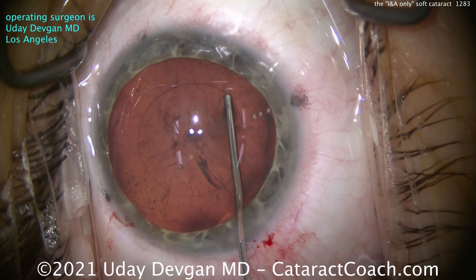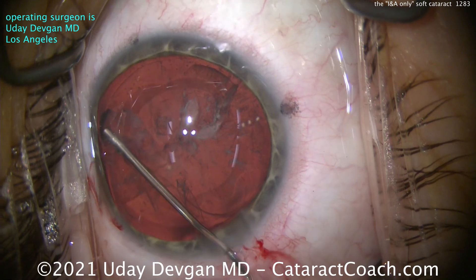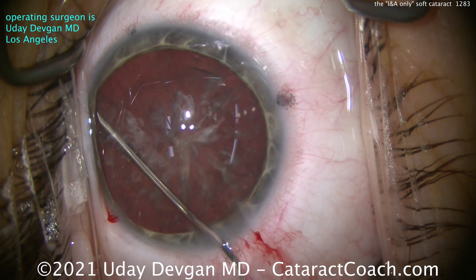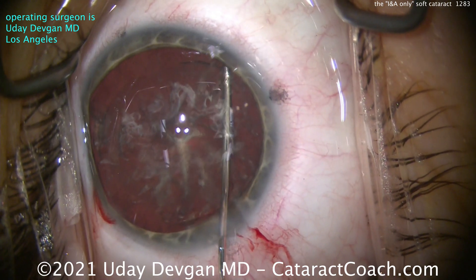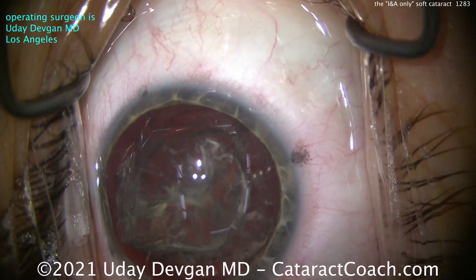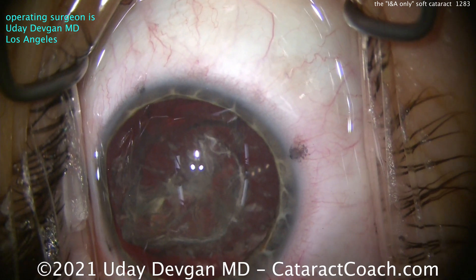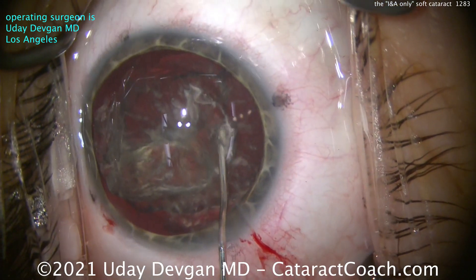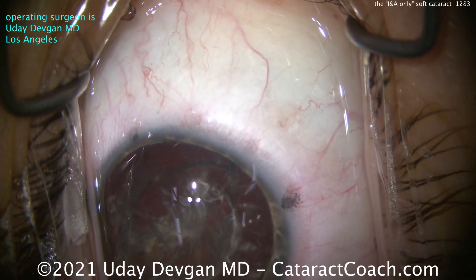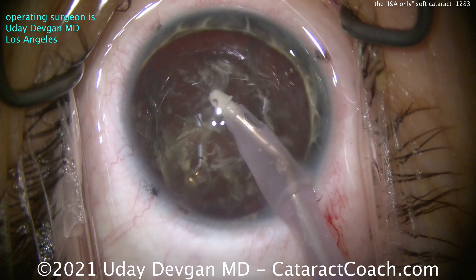The key step is hydrodissection — just get that whole nucleus out of the bag. It's soft, it's butter. So just hydrodissect. There you can see the cortical opacities became really opaque now. Get that nucleus up out of the capsule bag. There's no density here — you do not need a phaco probe, you don't need any ultrasound energy. So I'm just going to go in directly with the IA probe. Why put the phaco probe in? Just the IA probe.